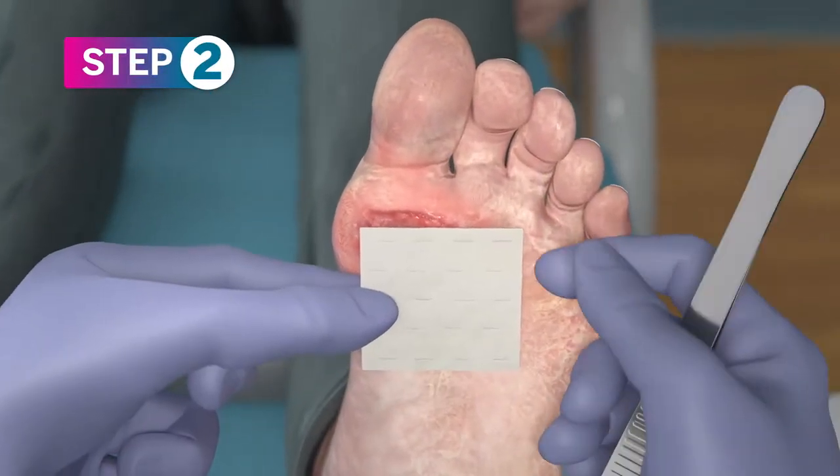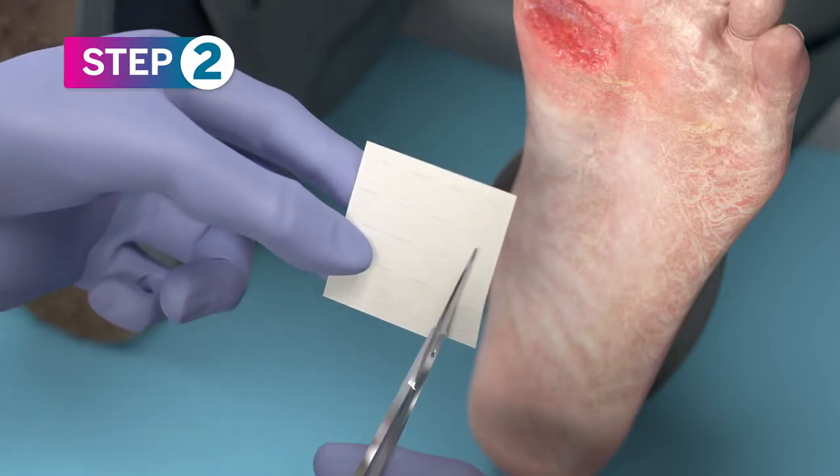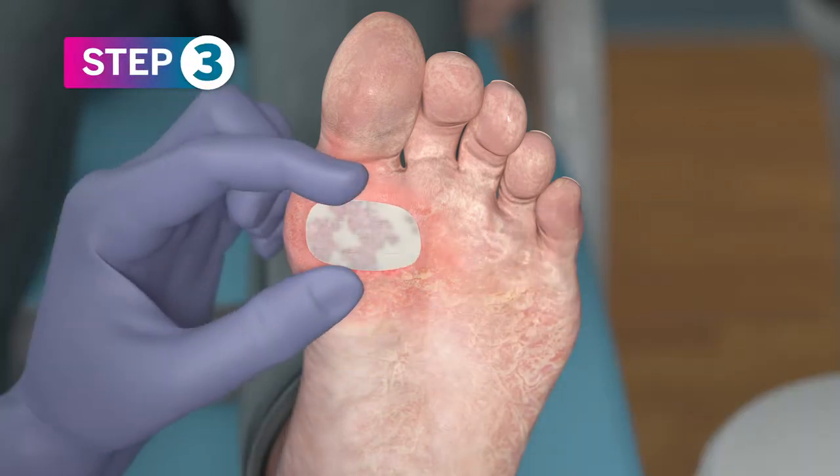Remove PurePly AM from the package. If needed, cut just enough to cover the wound. Place on the wound. PurePly AM will immediately attach to the wound and appear translucent.